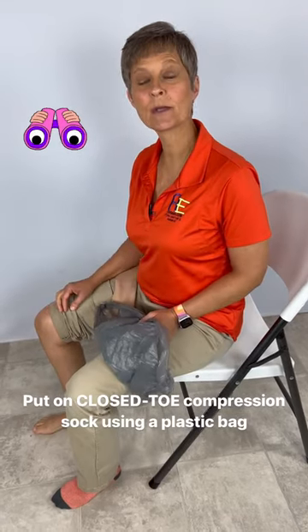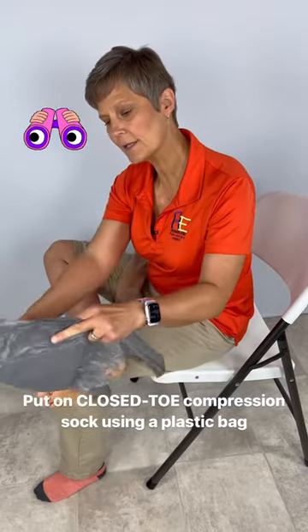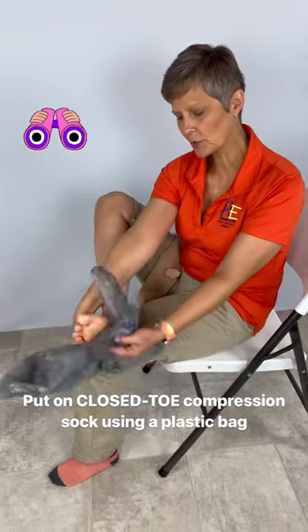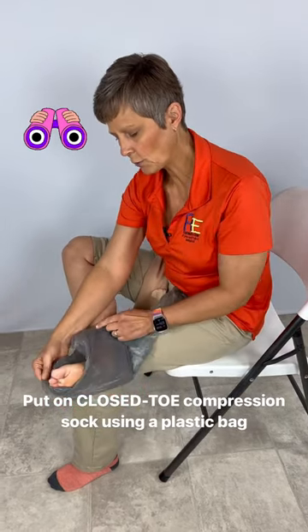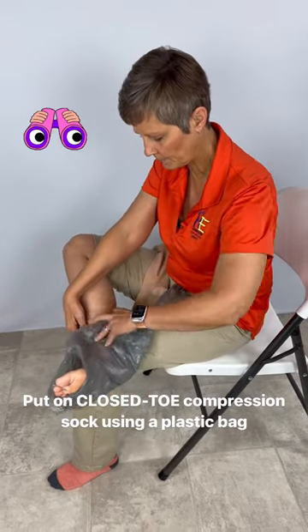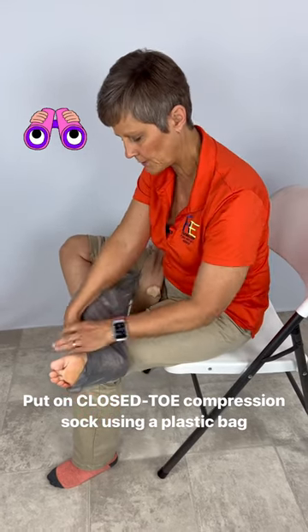Let's use a plastic bag to put on a closed-toe compression stocking. I'm going to put my foot up like this, take my plastic bag — the handles are going to stay up toward my knee — and I'm going to put the corner up toward my toes here, wrap this around my foot just a little bit, just like that.